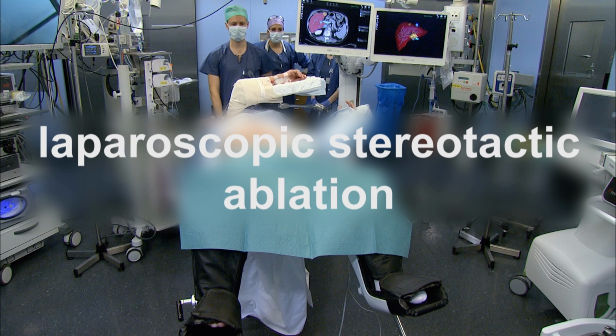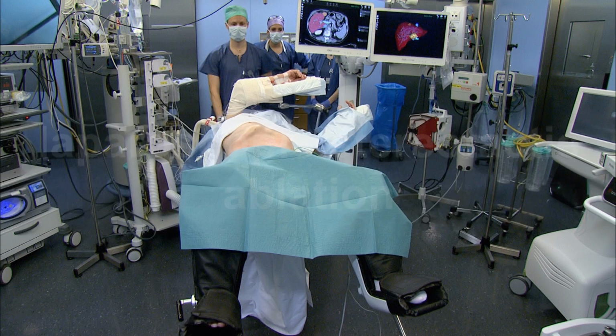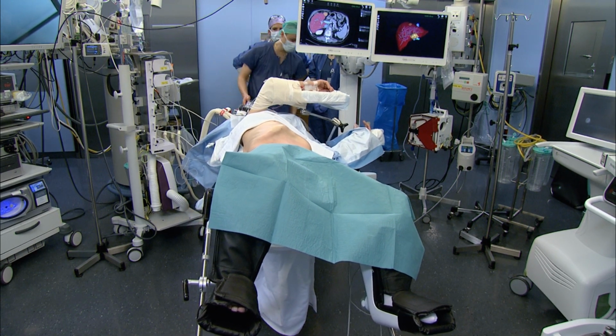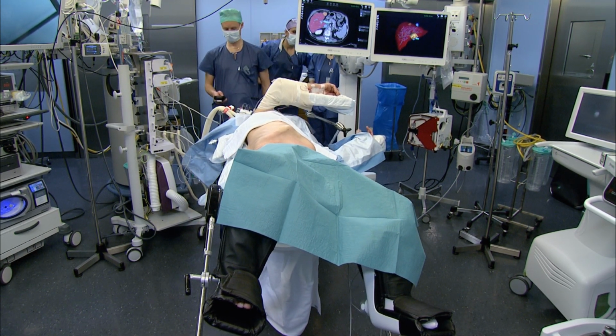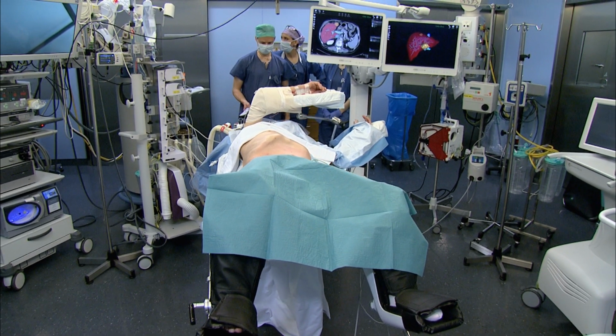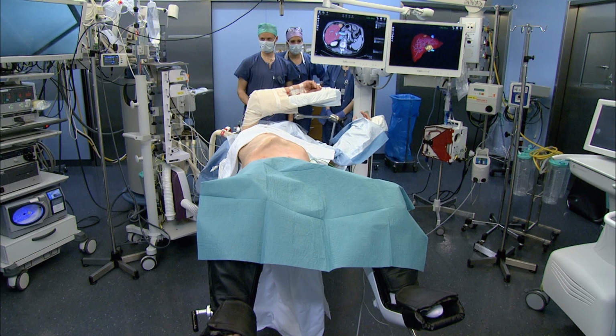Laparoscopic stereotactic ablations are performed in the operating room as standalone procedures or in combination with liver resections. For lesions located in the liver dome or the right lateral liver segments, patients are placed in French position with a semi-left lateral decubitus and the right arm placed on an arm board over the chest. This allows a rotation during surgery and a transthoracic approach.